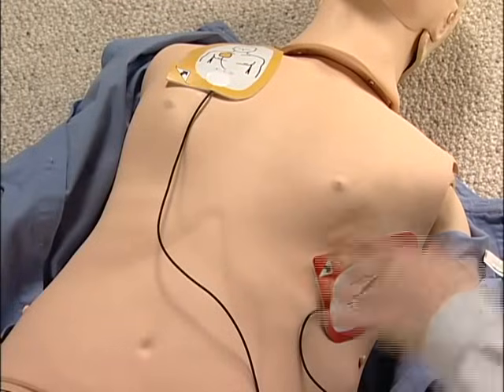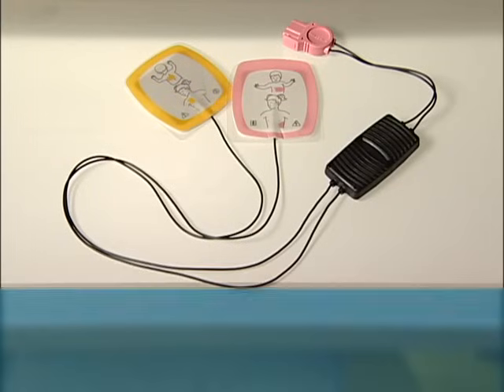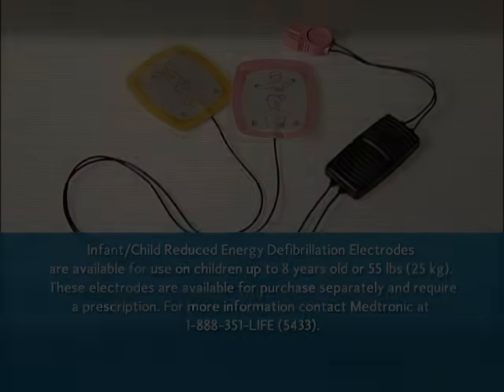These electrodes, the ones that come with the LifePak AED, are for use on people over 8 years old. There are special electrode pads that are for use with children under 8 years old. If you might need those pads, you should contact Medtronic for more information.